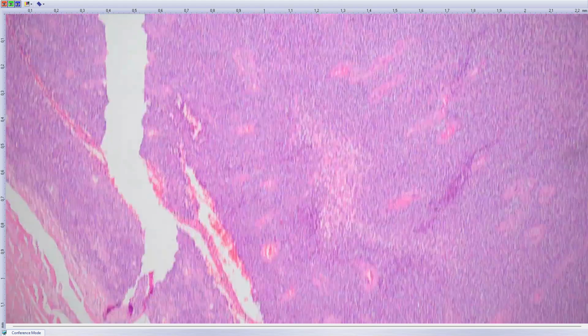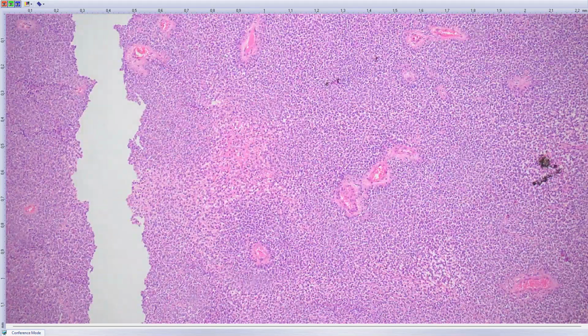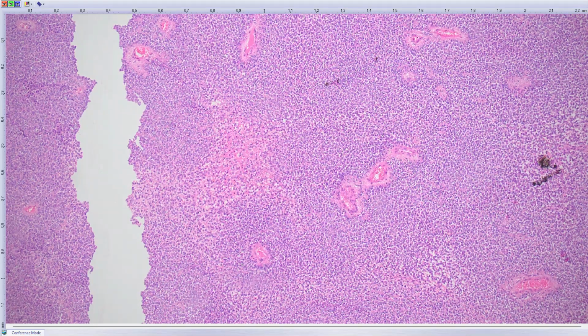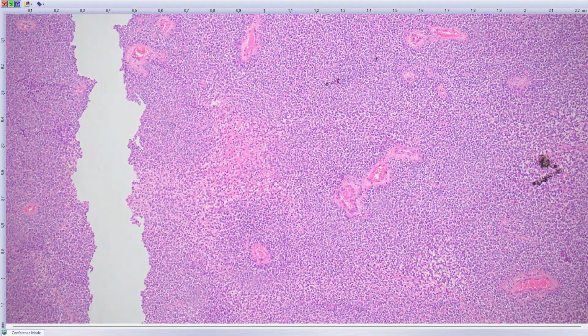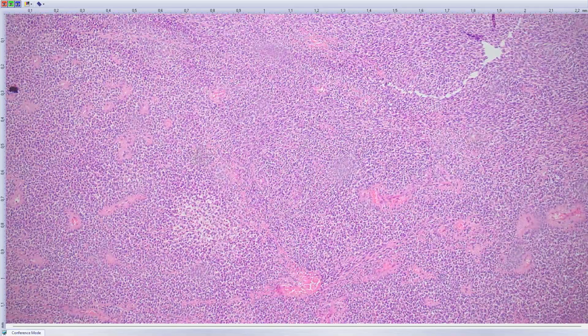And because this guy is a friend of one of our employees, we were asked to repeat the analysis with some more advanced, more comprehensive panel. So we used the very broad Illumina pan-cancer panel, which can detect fusions in almost 1,400 genes, and we got the result.